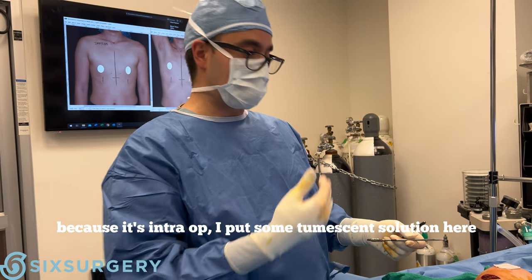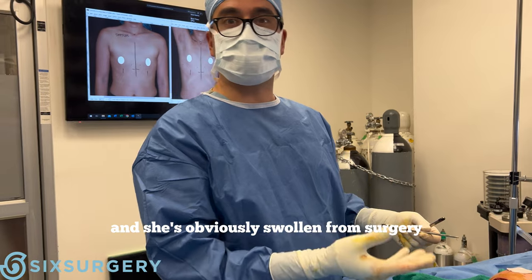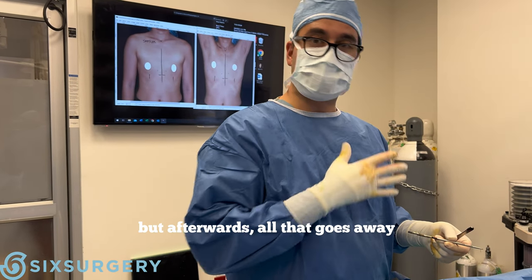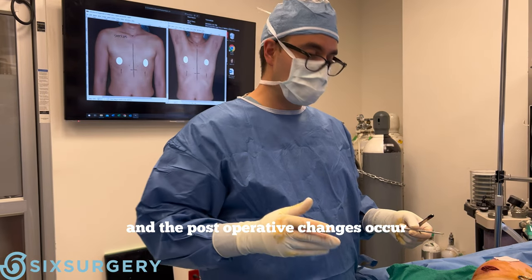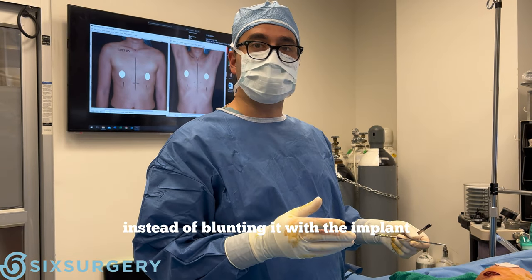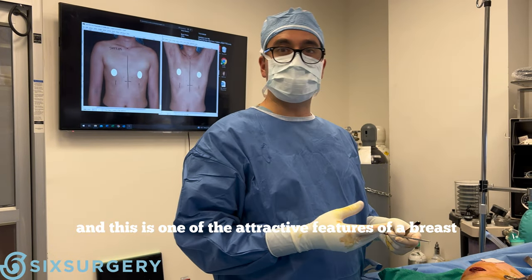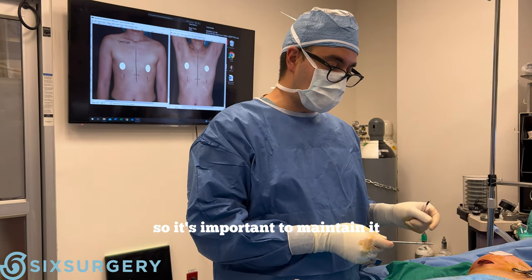Right now we're not going to see it really well because it's intra op. I put some tumescent solution here and she's obviously swollen from surgery. But afterwards, as all that goes away and the post-operative changes occur, you'll maintain a sharp fold there instead of blunting it with the implant. This is one of the attractive features of a breast, whether your breast is smaller or larger, so it's important to maintain it.